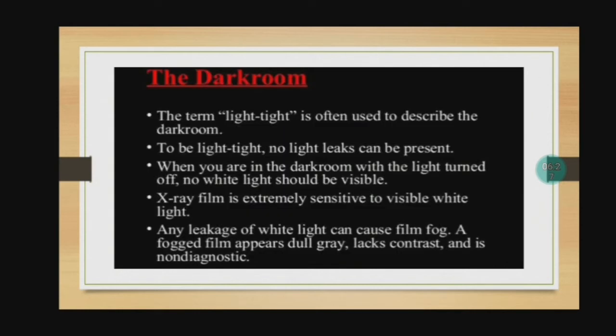The darkroom. The term light tight is often used to describe the darkroom. To be light tight, no light leaks can be present. When you are in the darkroom with the light turned off, no white light should be visible.